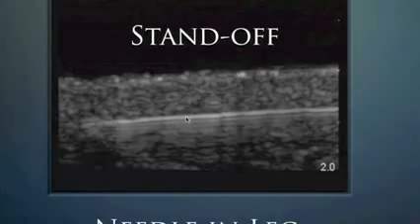Very superficial here. These are 0.5 centimeter hash marks, and in this patient, we could see this needle about 0.5 centimeters, or actually about 4 millimeters below the skin line, and this was a standoff pad being used up here. So very superficial, and we could see the long axis of the needle, the exact plane that the needle was in underneath the skin line.